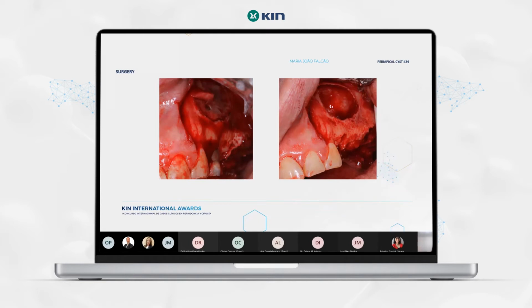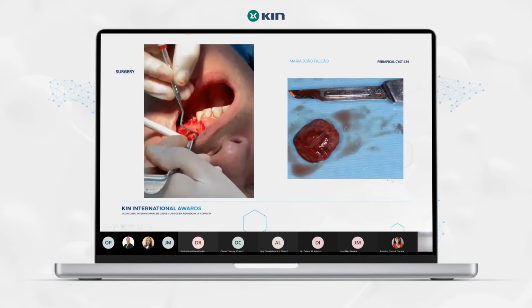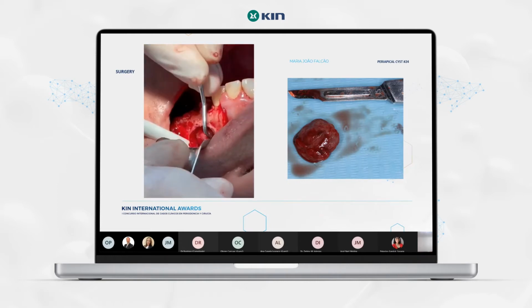That's not a problem. As you can see, we don't have any cortical in the vestibular bone, as we saw in the 3D exam. And we have a very big lesion in here. This is a video I did, I don't know if you can see it, of the enucleation of the cyst.